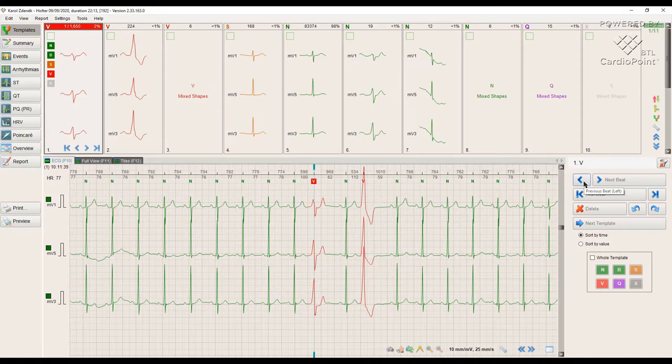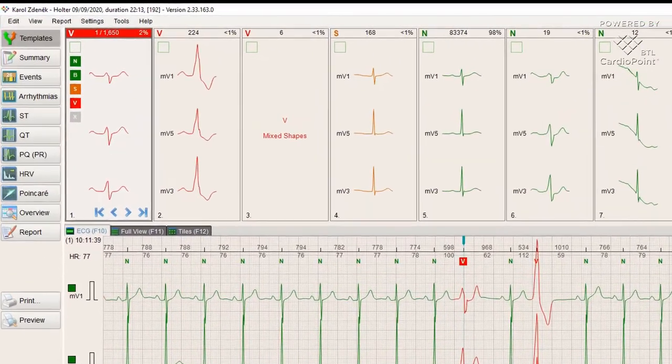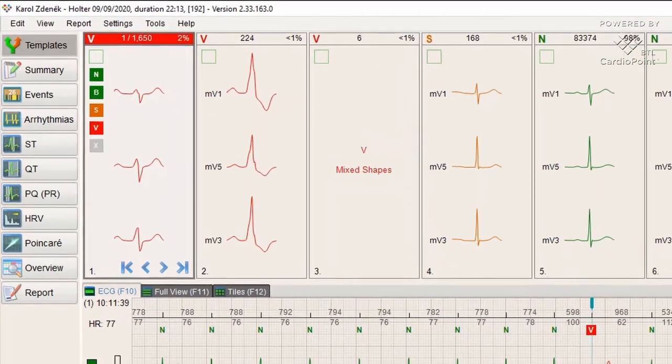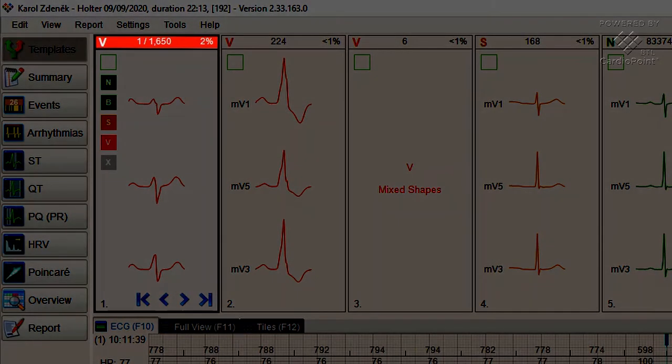The first template is determined as ventricular premature contractions. 1,650 PVC beats were recorded. It is 2% of the total number of beats in this recording.